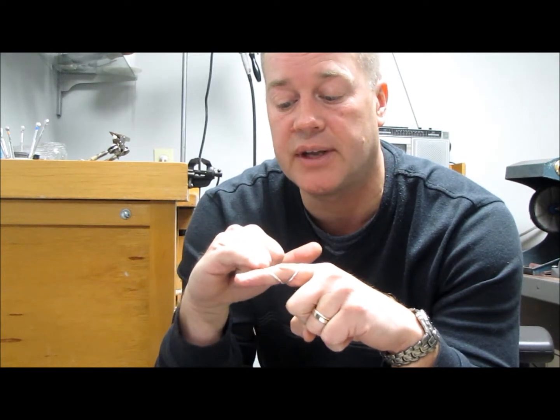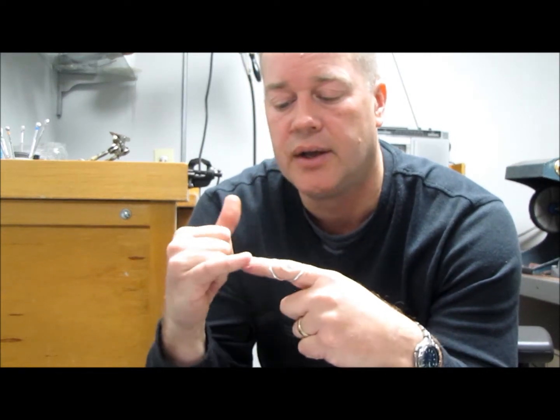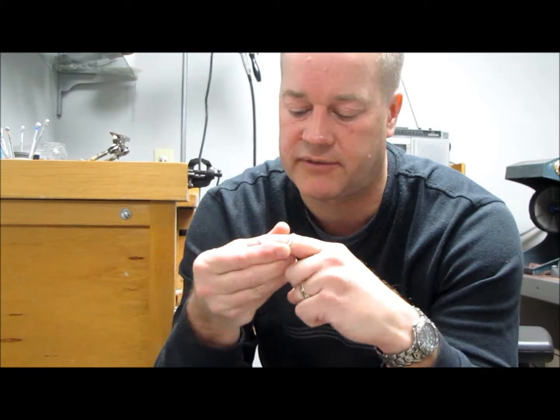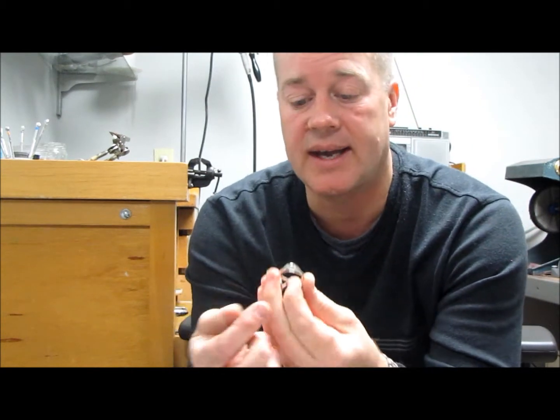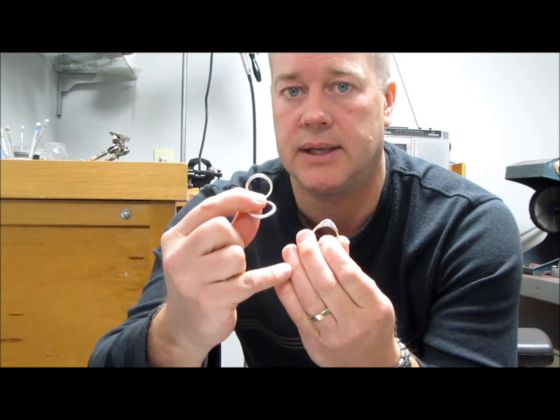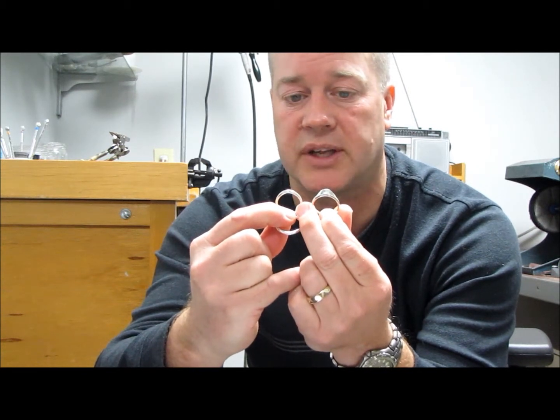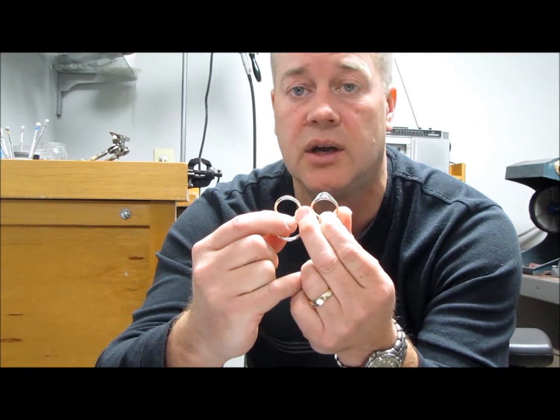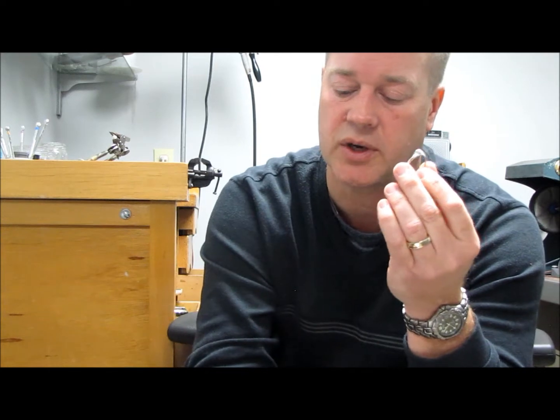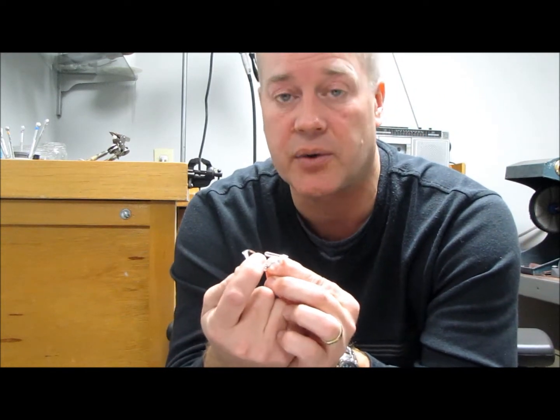There are a few things I can do to improve things if we have more than just hypermobility. Say we have to force a finger into position. Sometimes it can dig in on the top or the dorsal side. So what I can do is increase the surface area of that to make them more comfortable, and by doing that, I add a plate of silver. This here is a standard splint, and this here is a splint with a pressure plate on it. I can do that on the proximal ring, on the distal ring, or on both, if needed. All these little things are options. They're going to cost a little bit more. The other thing I can do is add lateral supports.